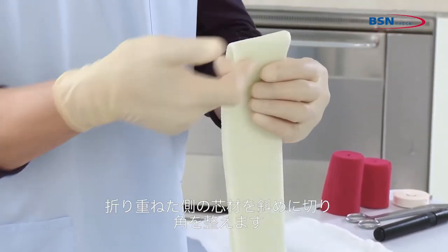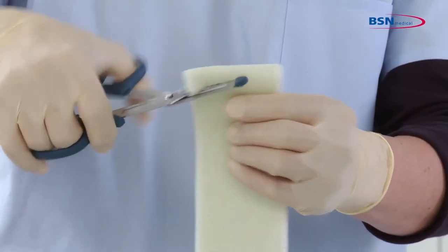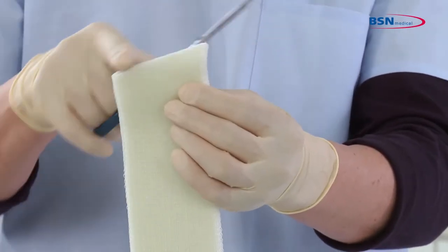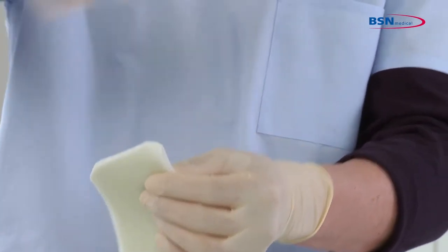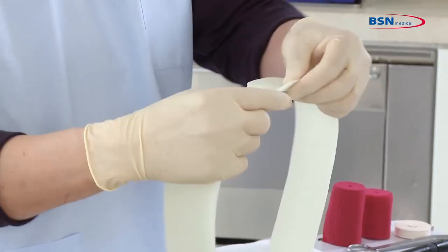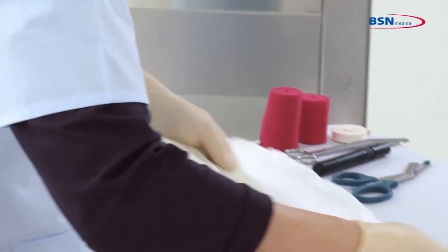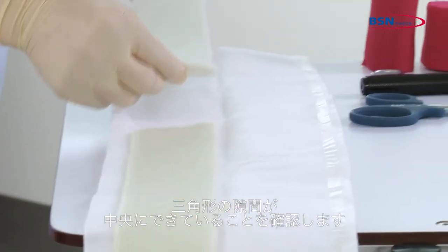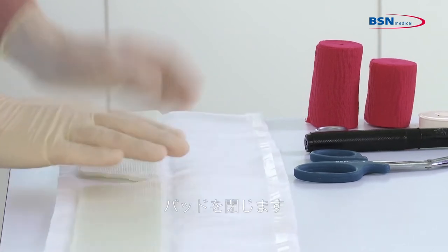Cut slightly diagonal across the splint and round the edges as well. Place both parts inside the padding and make sure the two cut ends form a triangle gap in the middle of the splint. Then close the padding again.